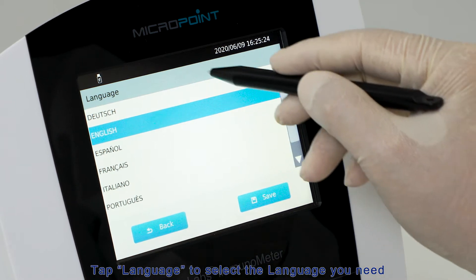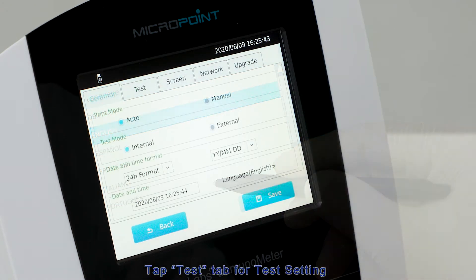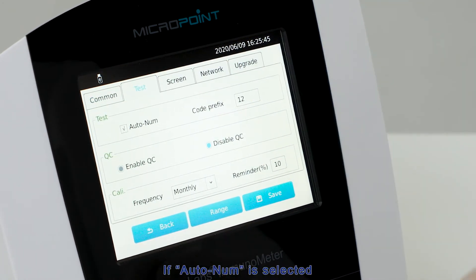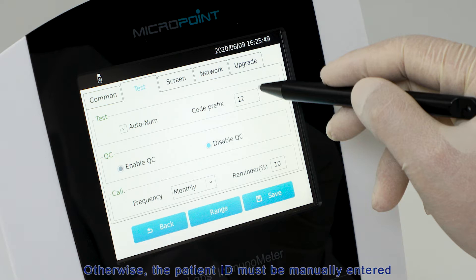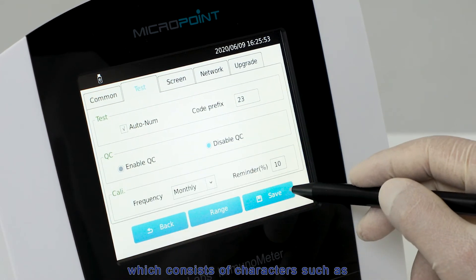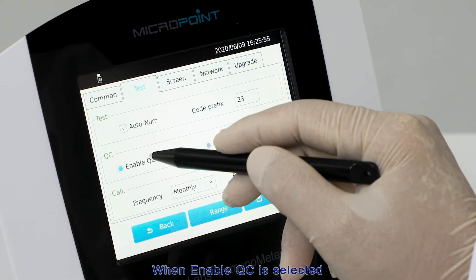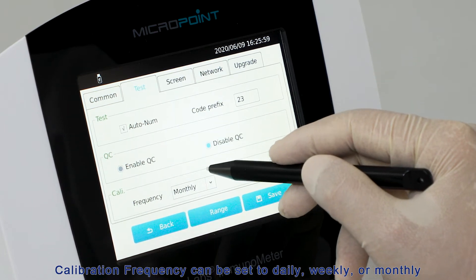Tap Language to select the language you need. Tap the Test tab for test settings. If auto-num is selected, the patient ID will be automatically generated when performing the test; otherwise, the patient ID must be manually entered. You can set a code prefix inserted before each automatically generated patient ID, consisting of case-sensitive alphabetical letters. When Enable QC is selected, if the QC test fails, no sample test will be allowed. Disable QC means the QC test results will not affect the sample test. Calibration frequency can be set to daily, weekly, or monthly.